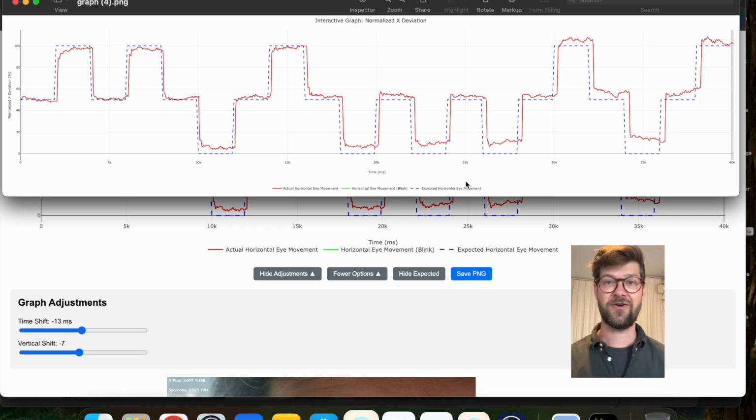So that's the end. I hope it's clear. Like I said, there's lots of separate videos explaining lots of parts of this. This was more the overview.